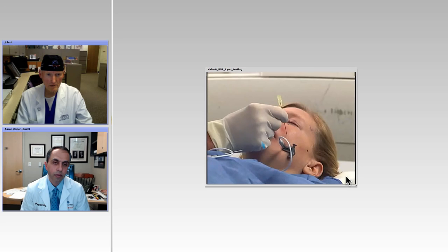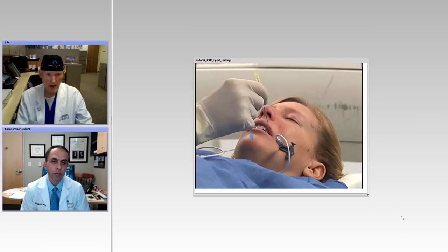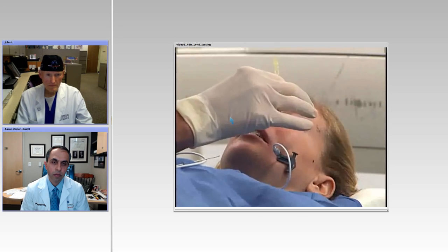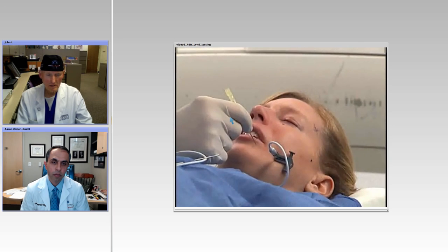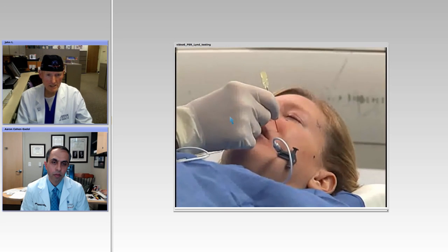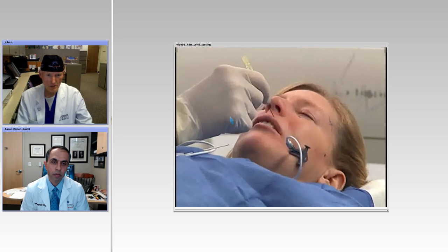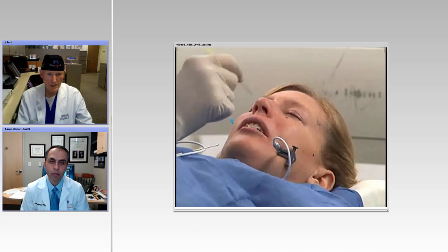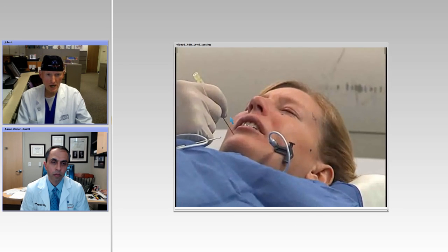So using a sharp stimulus, you watch how the patient reacts when you reach the midline. You can see that she is identifying it as sharp in the forehead and much less sharp in both the second and the third division. And you also get the visual hint by watching the patient. And then the patient can compare the two sides.